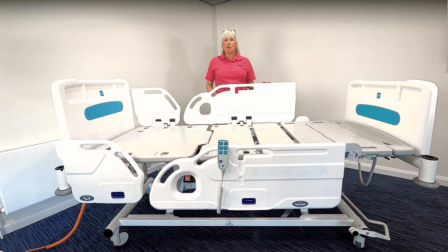The bed can accommodate patients of a length of up to 185 centimetres. However, it does have an extension facility and that can then accommodate a patient of up to 205 centimetres.